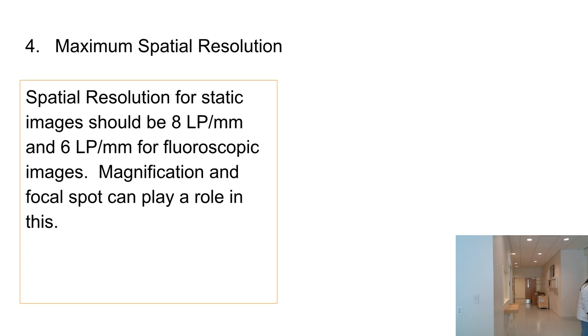So this one was the 1470? The one where the markers by the wrist is the 1470. Okay, good, so I'm happy. So yes, when you use the larger size cassette, you get a miniature image. Okay, yay. That's why it's lab within the lab. If that was a real lab, it would be done.